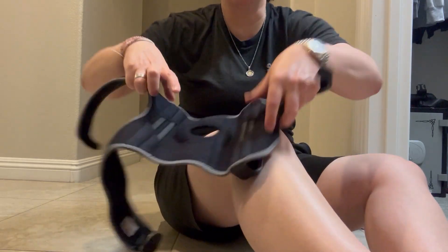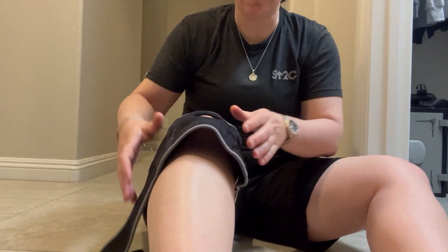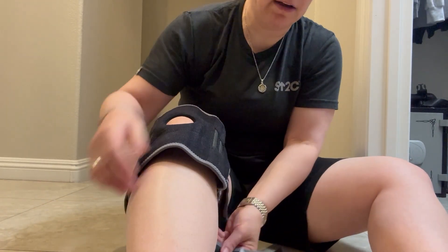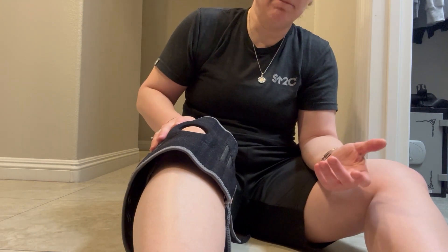Hey everyone, so I am here with Dr. Brace's knee brace. I absolutely love this thing. It's been really, really terrific for my knee and I wanted to demonstrate putting it on for you.